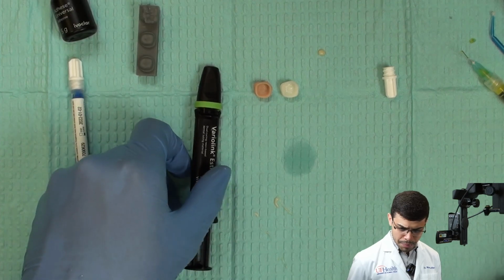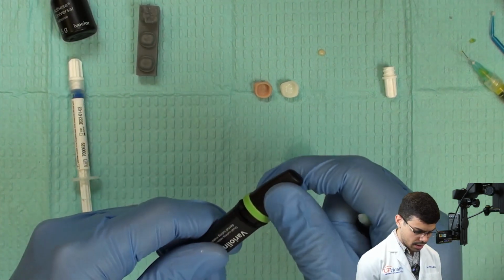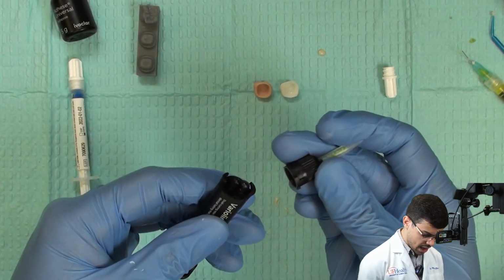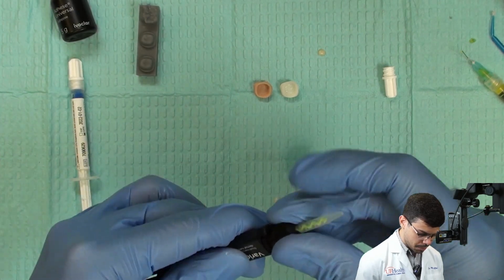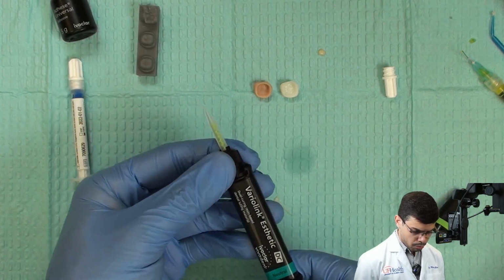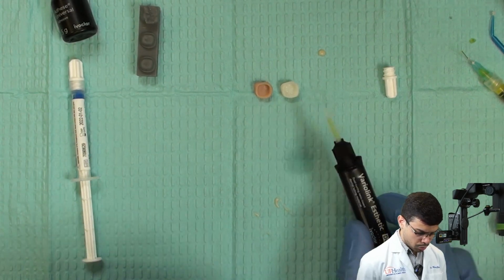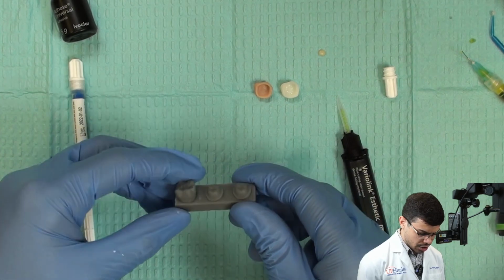So I'll just prepare my resin cement here. So this is pretty simple. You just have a cap here that we're gonna remove, and we're gonna add the mixing tip. You're gonna notice that the mixing tip is black and green. So this is ready to be used. Now it's time to do the etching on the tooth, okay?